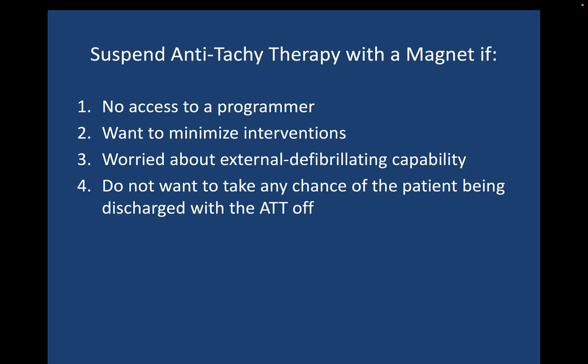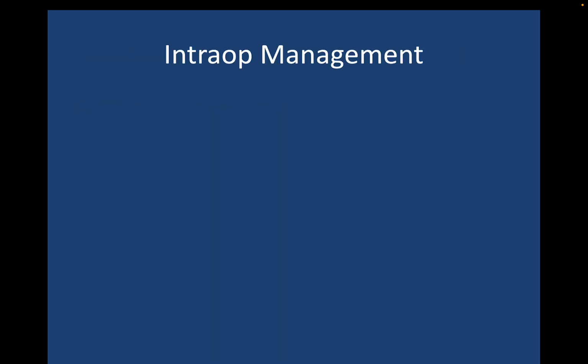If you're just worried that the patient's going to get sent home without the anti-tachy therapy being turned back on, then a magnet is a good choice for that situation. All right, now what about intraoperative management? We talked about the preoperative management. That's where the big decisions are to be made.